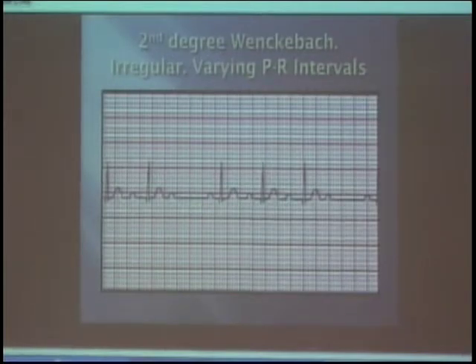If they're perfusing and they have a BP, you don't have to pace them. You put the pads on, which means most of the time I see these patients, they do have a blood pressure and they are perfusing, they're just kind of slow. So we keep the external pacer on until they go to the unit and then decide what they're going to do. A lot of times this is drug induced, these blocks. Frequently they're drug induced and they just wait and they resolve.